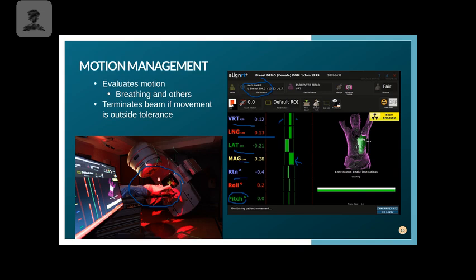You can also do what we call a recapture. And so what it'll do is, let's say you get everything set up on the table and this is still red and your imaging looks good. Your doctor's happy with your picture saying you are spot on, but this thing is not right. You can recapture and it basically just resets itself to that moment in time saying, okay, this is actually what we want, and we can reset it based on our physical proof of imaging. So it's not a, oh man, something's not lining up here. Your doctor can give you the approval to recapture if needed.